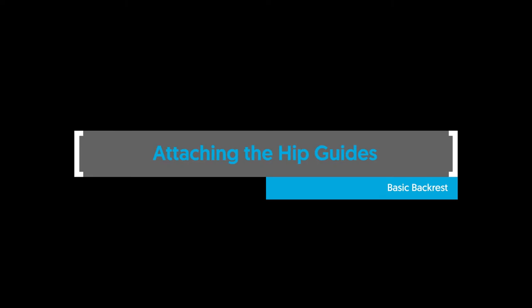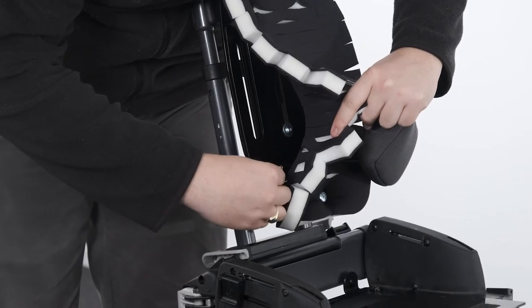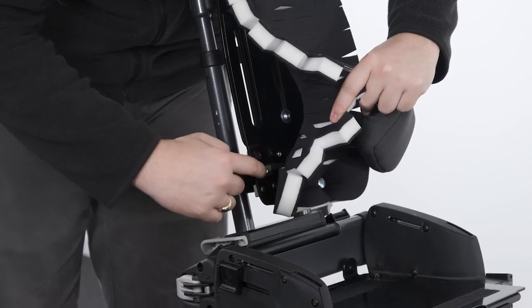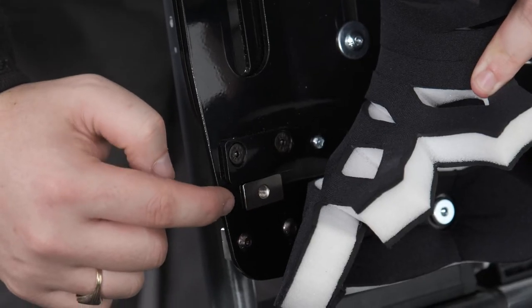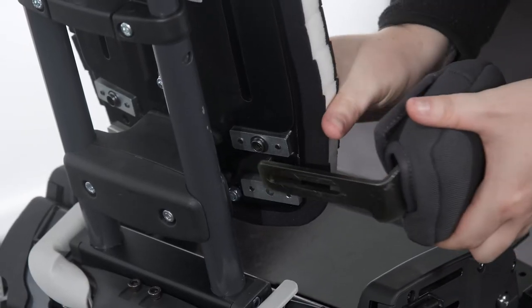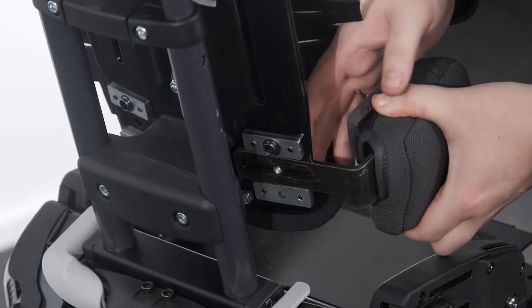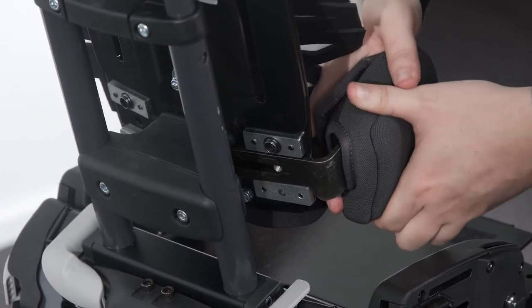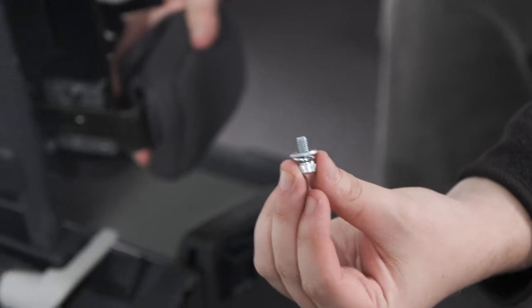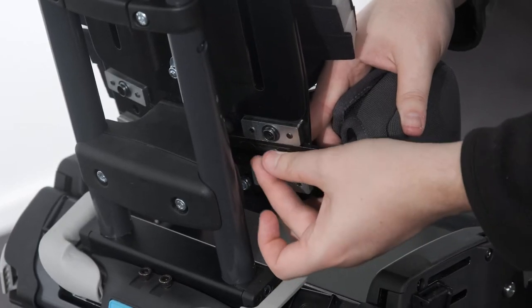Attaching the hip guides — basic backrest. To attach the hip guides to the basic backrest, place the T-nut into the hole at the front of the basic backrest platework, ensuring the long edge of the T-nut is in line with the rectangular plate. Place the bracket into the recess at the back of the basic backrest platework. Place the split washer then the plane washer onto the bolt and pass it through the slot, engaging the threads of the T-nut. Secure in place with the Allen key.